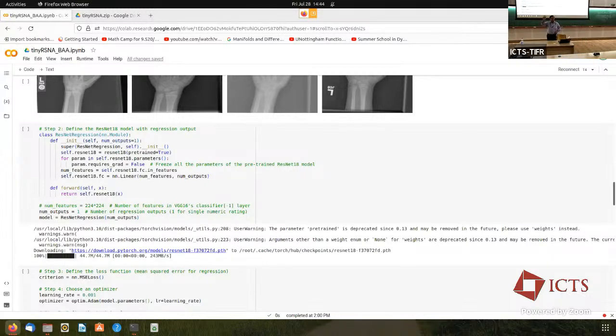The number of outputs in the final layer is fixed. You wipe it and you place only 1 neuron and connect everything to it. Okay? Let me just draw it real quick. So you've got a bunch of layers. There's a certain number of outputs in the standard ResNet. You clean it up, place 1 unit and connect everything in the previous layer to it. That's what you have to do for transfer learning.